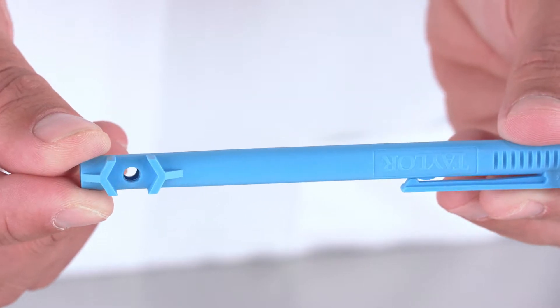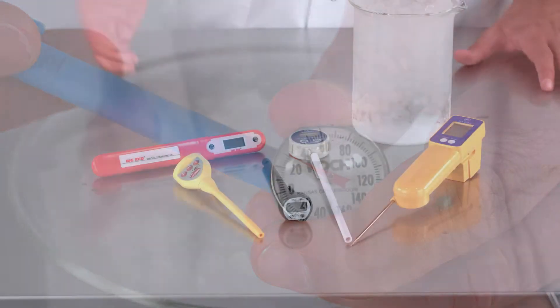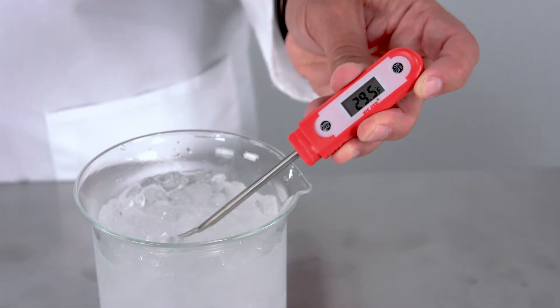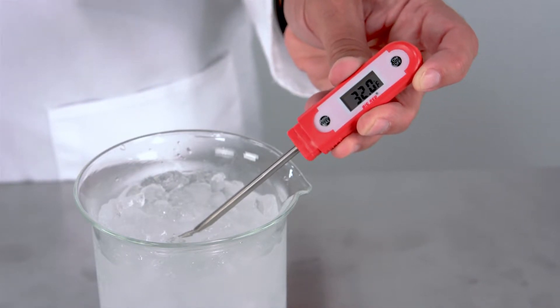Some calibratable metal thermometers come with an adjustment wrench built into the sheath, making searching for the wrench unnecessary. Most digital thermometers are not calibratable, but the ice bath method will work perfectly to verify their accuracy as long as the thermometer's range extends below 32 degrees Fahrenheit.